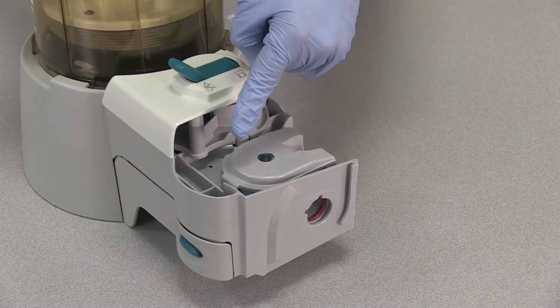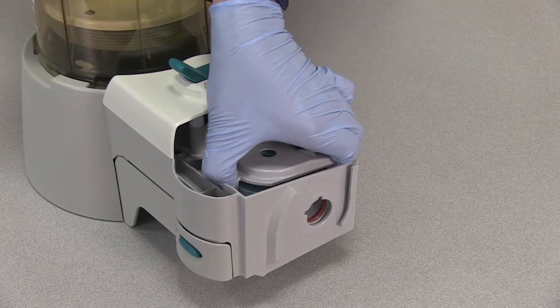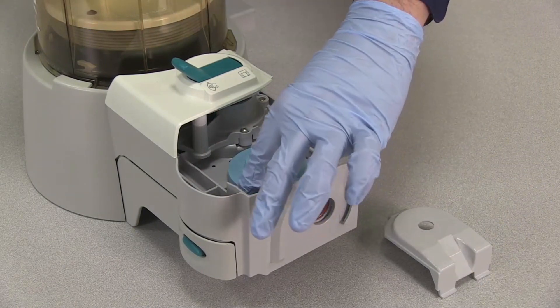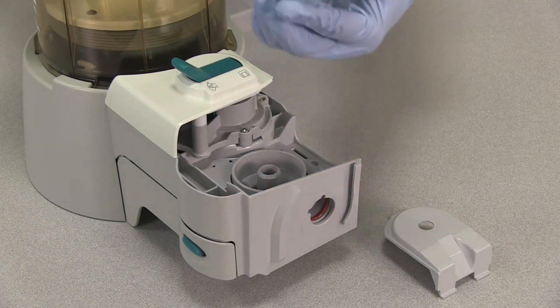Press the latch on the bellows assembly to unlock the ramp. Lift the ramp and remove the tabs from the slots to remove the ramp. Lift the APL valve diaphragm to remove it.